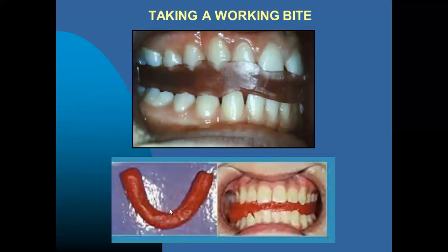This is how the bite looks. This is the wax trim as we've shown before. The bite is taken in the edge to edge position.